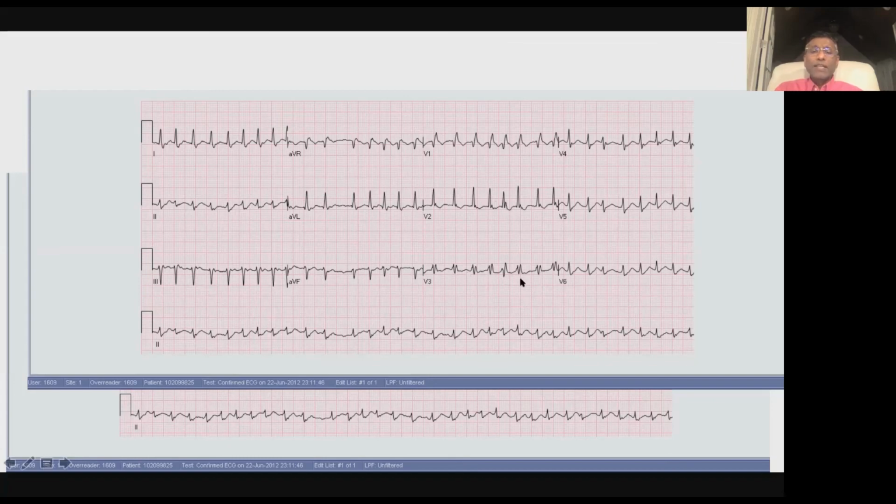And irregularly irregular, atrial fibrillation, you've correctly identified the underlying rhythm as AFib here. And I think you've already got your broad diagnosis here, which is atrial fib conducting with bundle branch block. Because you have a typical RS R prime here, a typical right bundle complex, and similar in lead AVR. So just AFib conducting with bundle branch block. Good, good, well done.